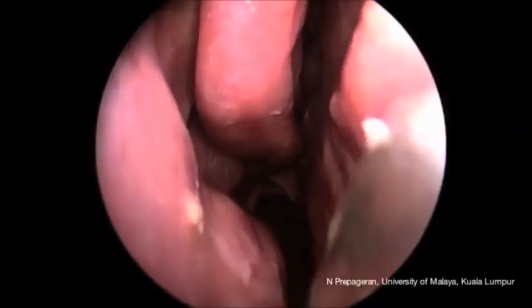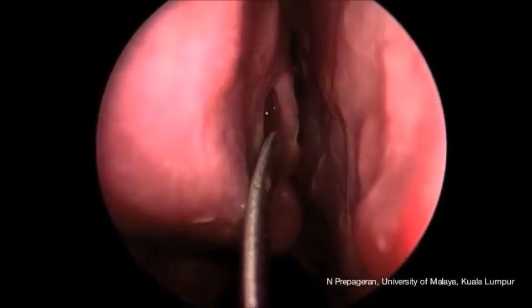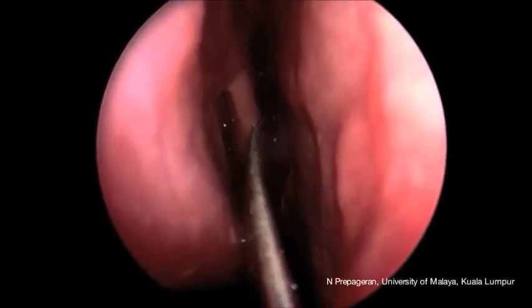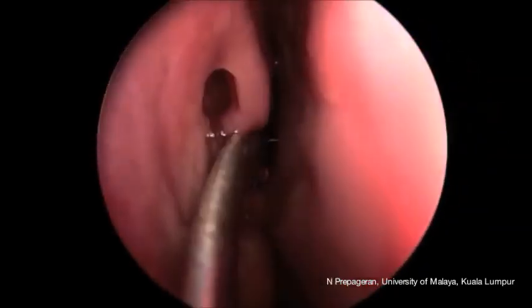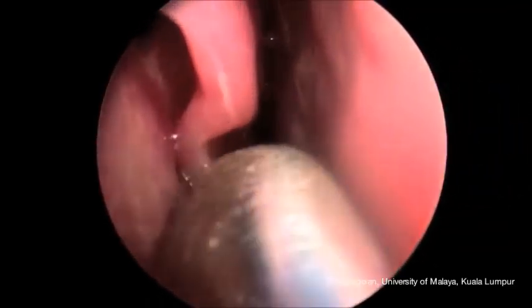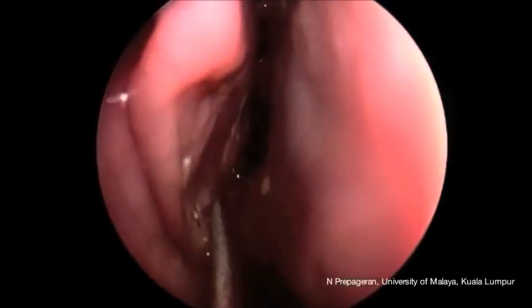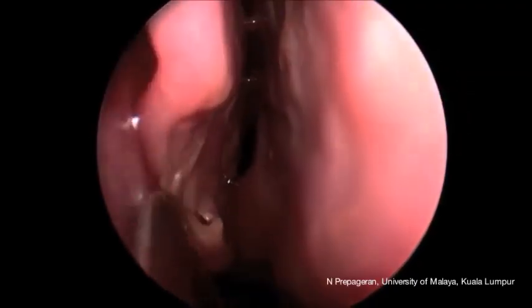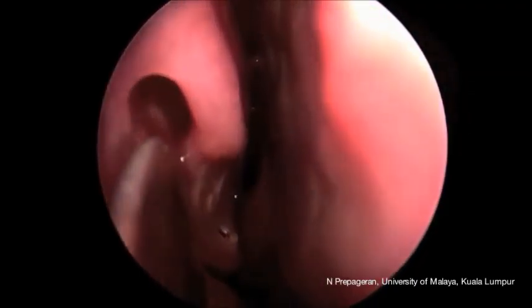We are visualizing the middle turbinate, and we gently push the middle turbinate laterally. That shows us the superior turbinate there. And to find the sphenoid ostia, we gently again push the superior turbinate laterally, go between the septum and the superior turbinate, and there you can see the sphenoid ostia.